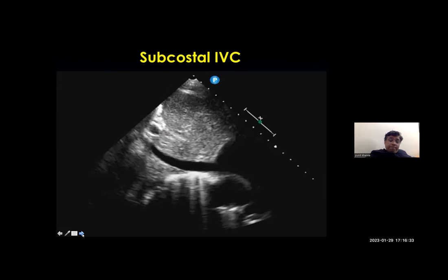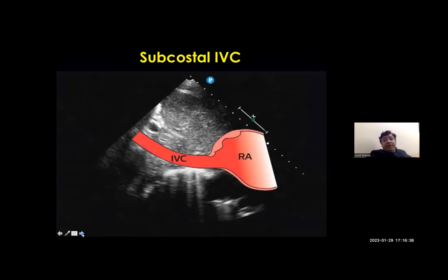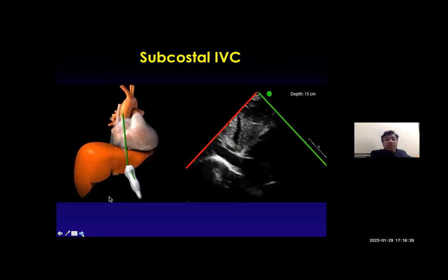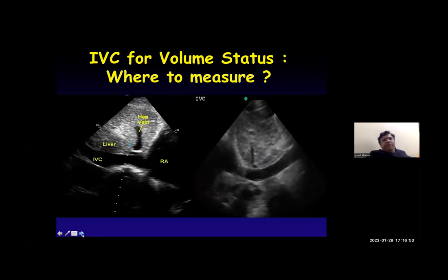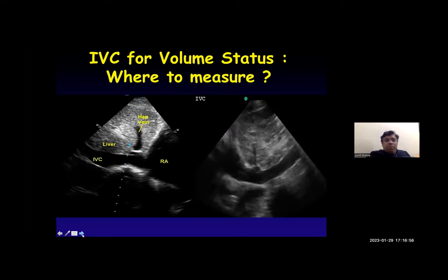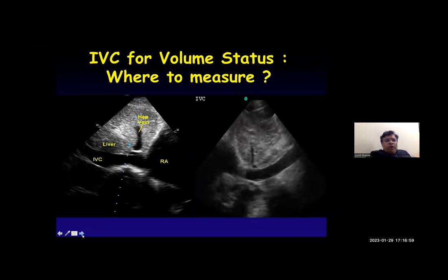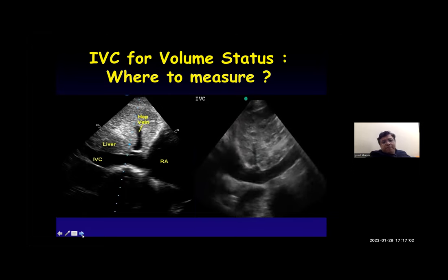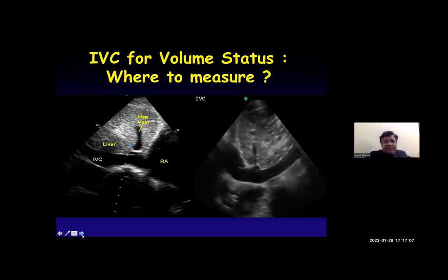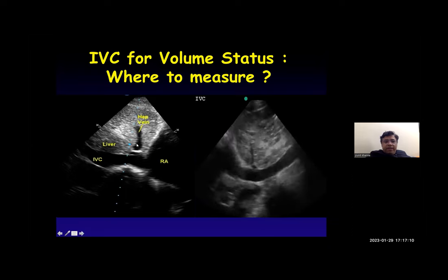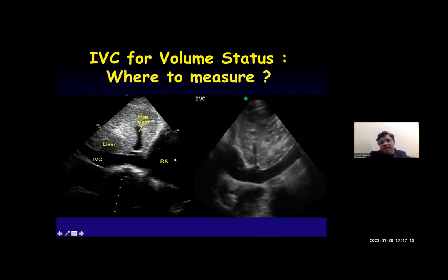The subcostal IVC view shows the IVC draining into the right atrium. The probe orientation and marker orientation are changed for this view. The main reason to look at the subcostal IVC is to measure the volume status of the patient. The IVC is measured just adjacent to or below the hepatic vein — you can see the hepatic vein, the IVC, the liver, and the right atrium.